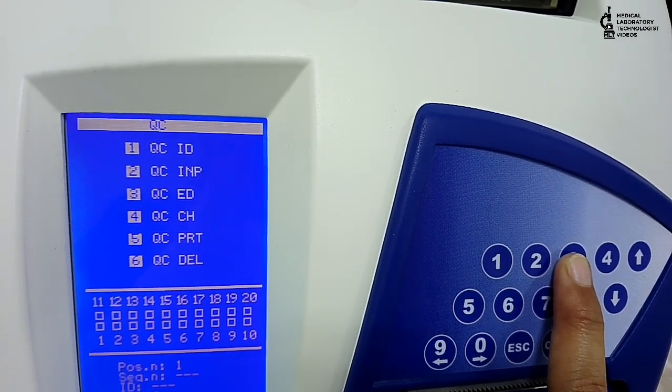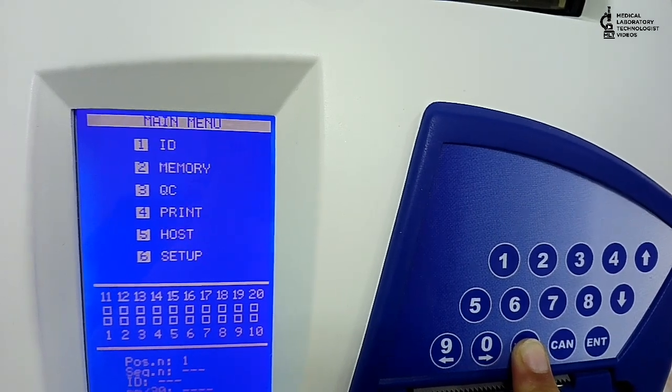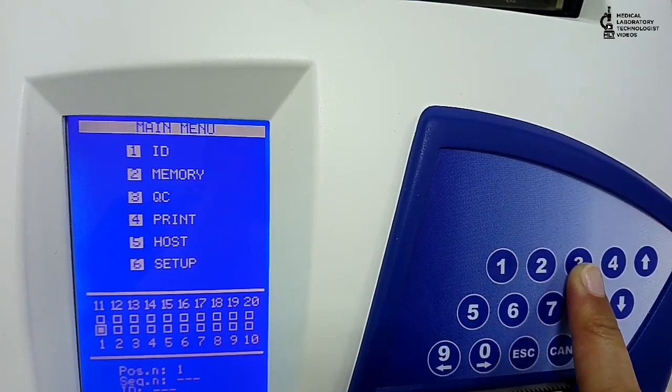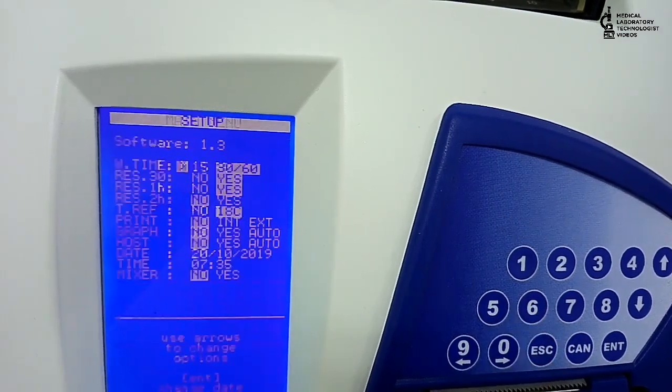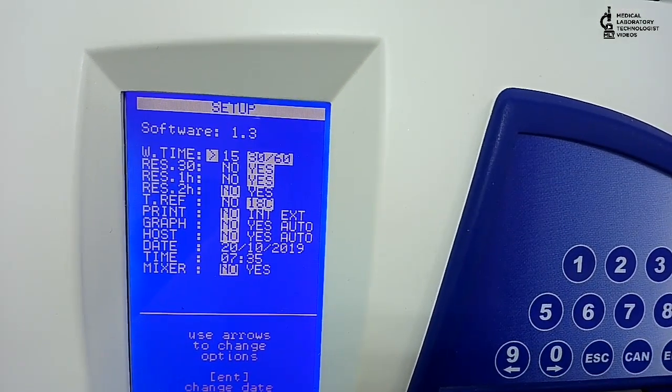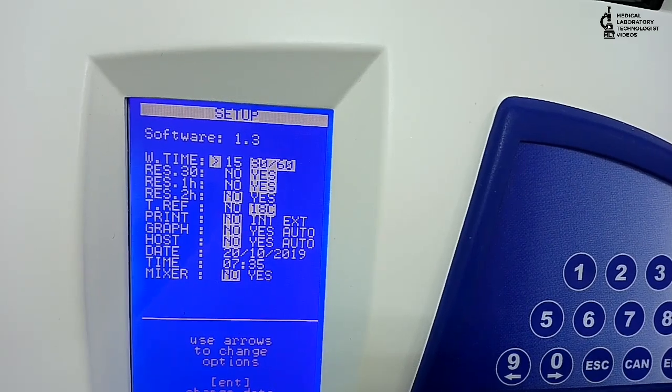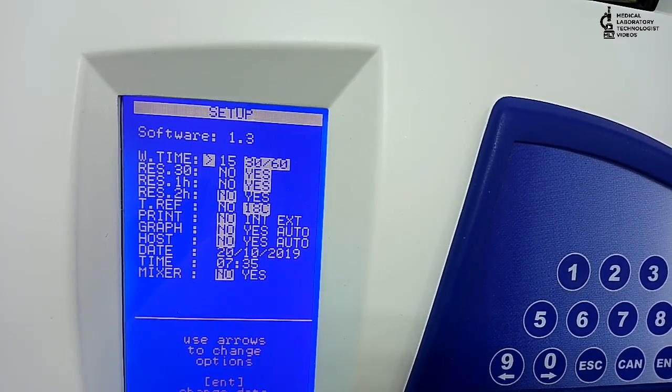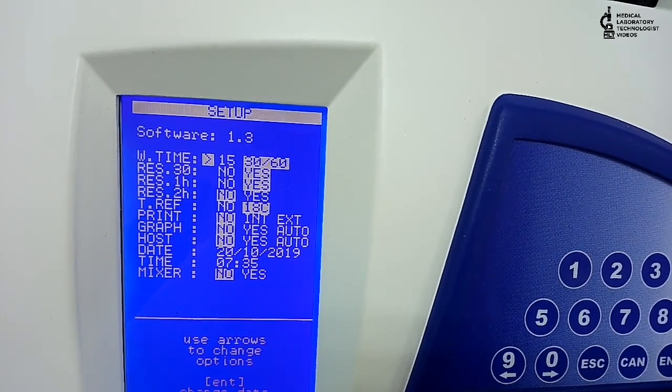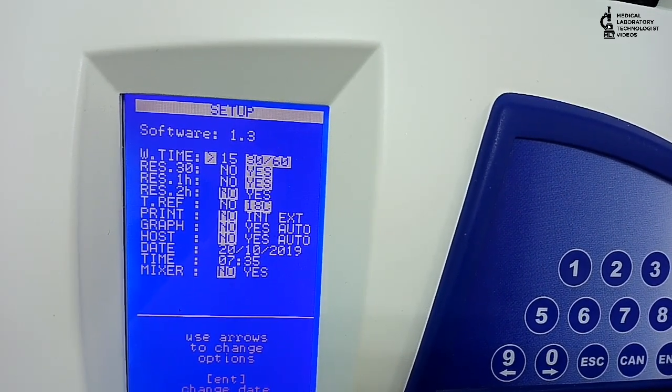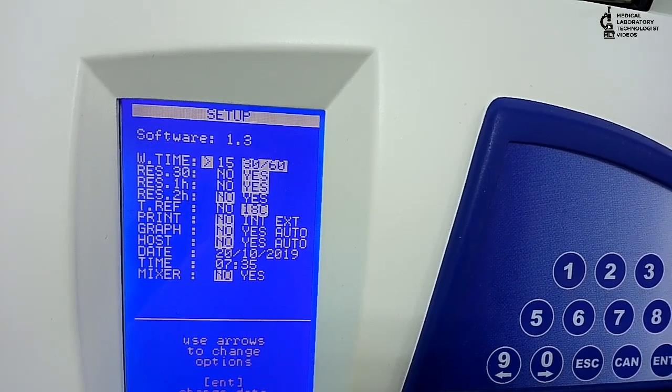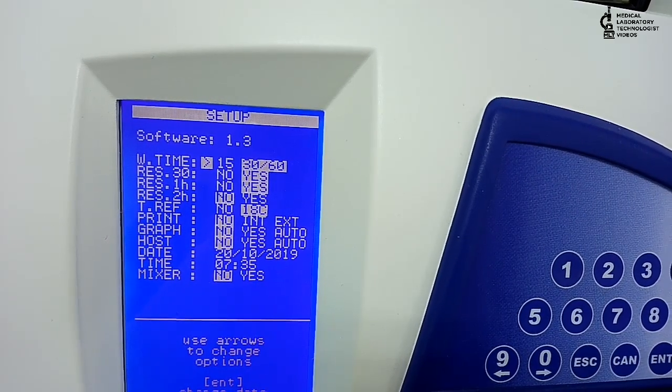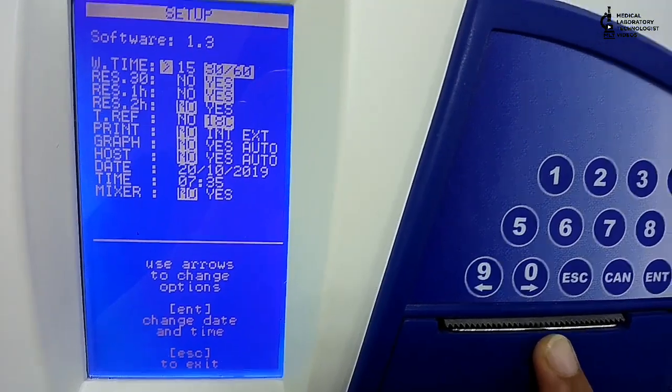First is QC ID that we will read as a barcode. Fourth is print, and sixth one is important - that is setup. In setup, you can see that if we want results within 30 minutes, we can get, and if we want result in one hour or two hours, we can get. Print option, graph, host, date, time, mixer - all these options are in setup.